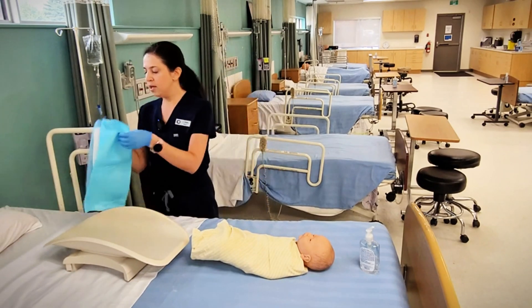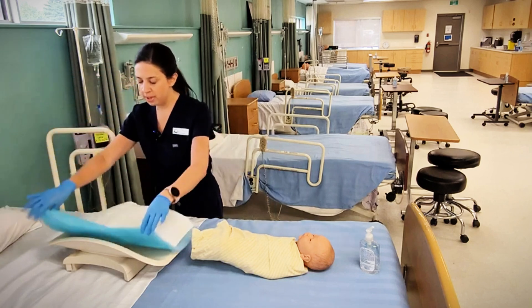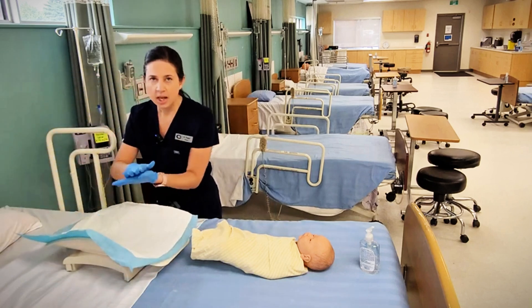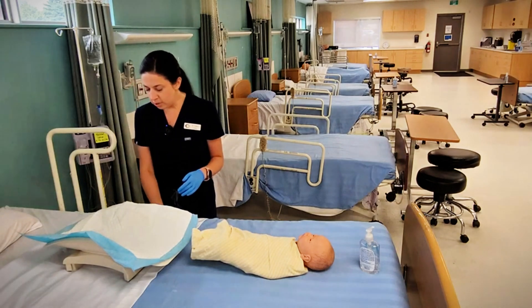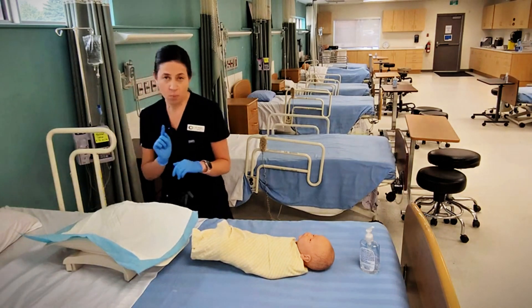I'm going to turn on my scale and put down my blue pad. We want to put down a blue pad just so baby doesn't get cold directly against the scale. I'm going to zero it so it's completely at zero, and I'm going to weigh in grams.